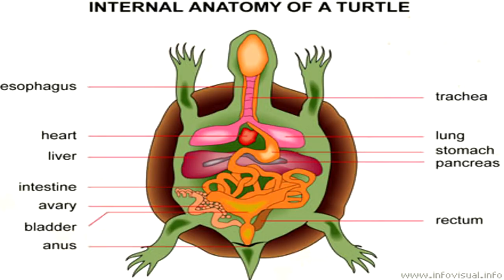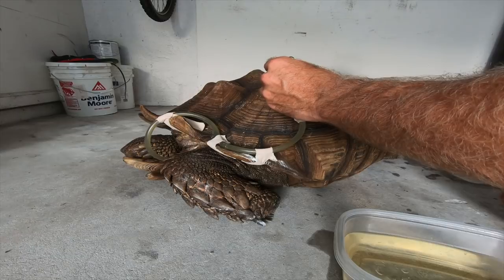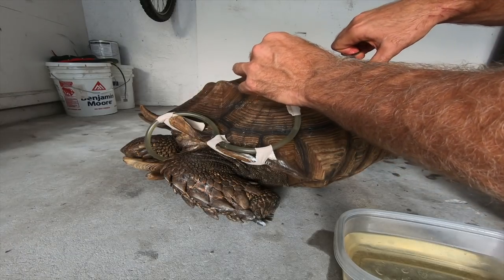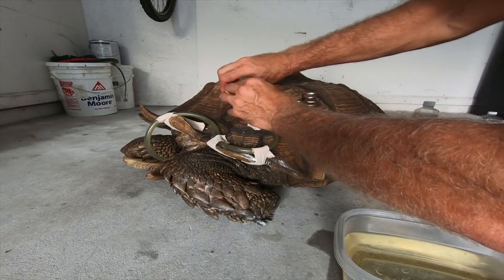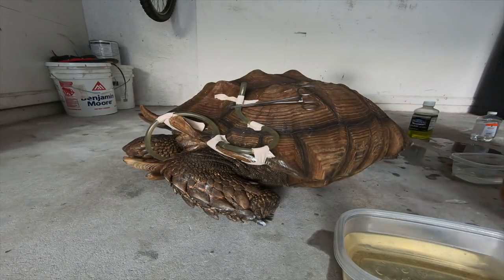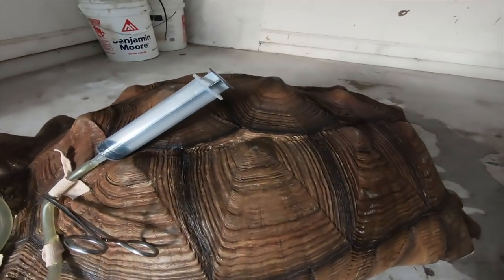We really got to restart him. So that's what I do in the evening, when he goes to bed. And then what I like to do also is I just take these forceps and I clamp down, and this keeps any air from really getting into his stomach. We'll just go ahead and tape that like that. And then I also just put a syringe right on the edge there, and he just relaxes. So basically that's what I do in the evening.